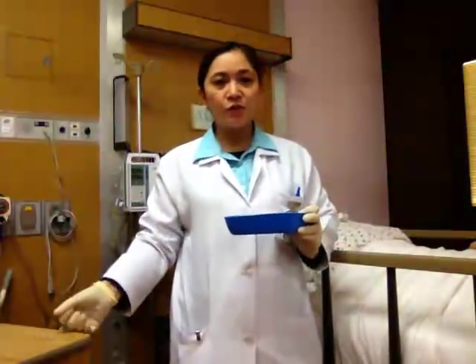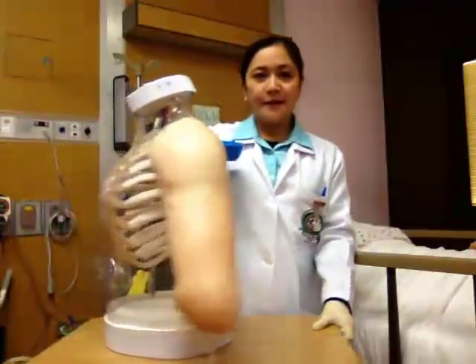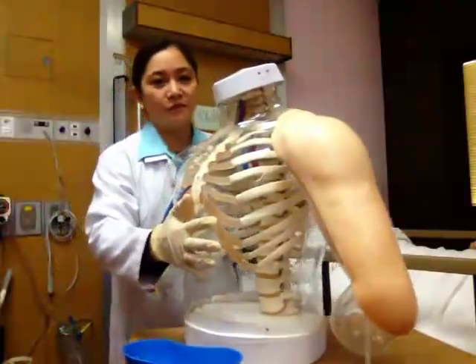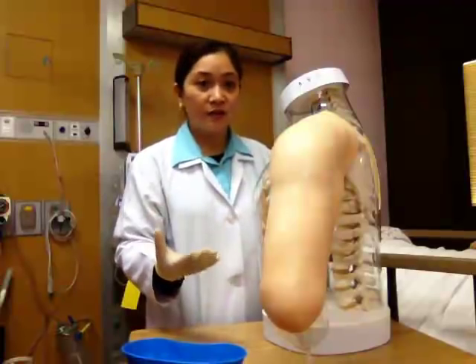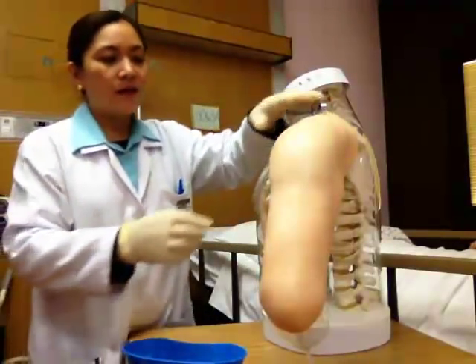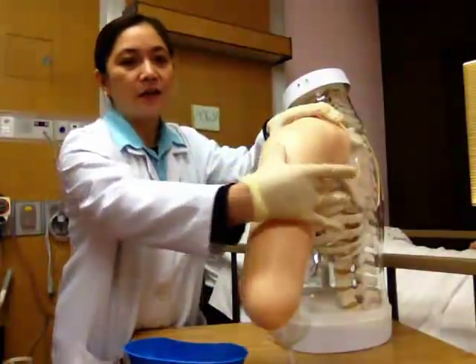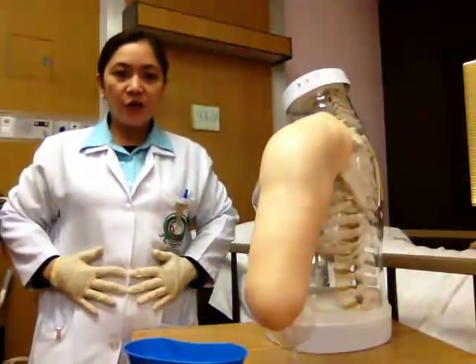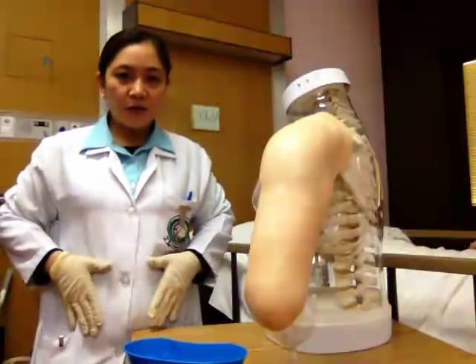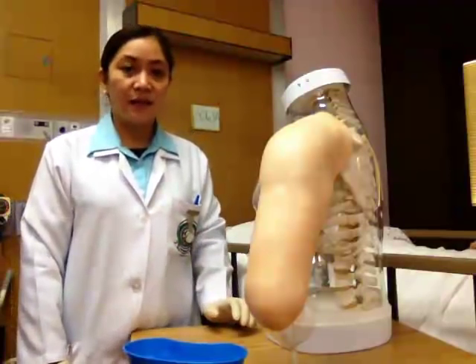Okay, so to have a better look and a better demonstration, I'm going to do it on our arm simulator. This will be our patient, wherein I'm going to inject, let's say, insulin subcutaneously. In giving subcutaneous injection, we have different sites. We can give it to the lateral side of the patient's arm. We can give it to the abdomen of the patient, the right and left parts of the abdomen. We can give it to the lateral side of the patient's thigh.